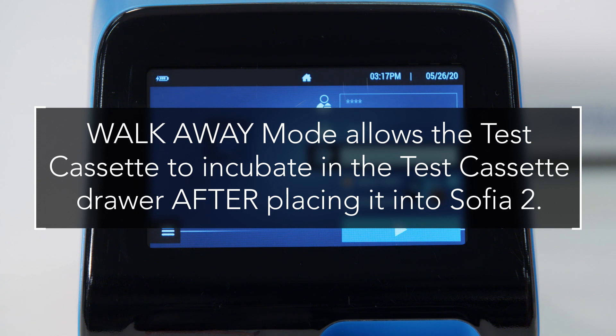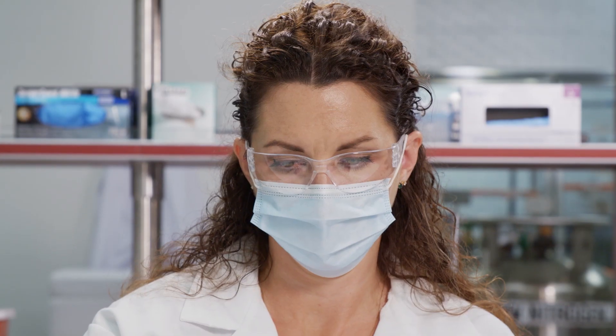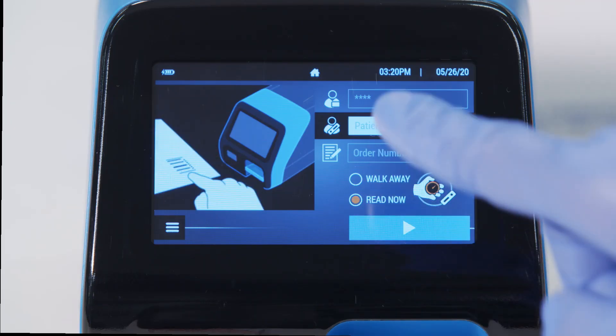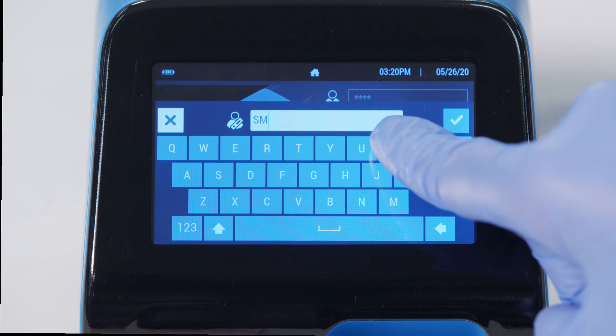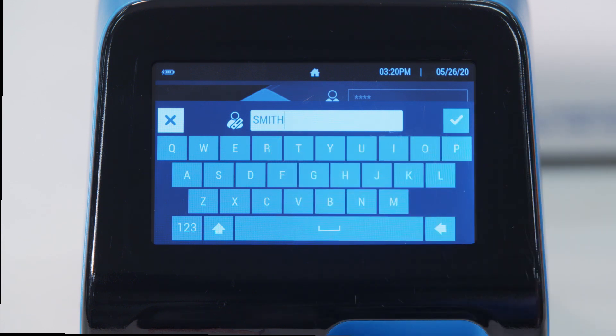SOFIA2 SARS Antigen FIA can produce positive, objective results in 15 minutes. To begin testing, after emptying the contents of the patient sample into the cassette, ensure SOFIA2 has been powered on and the run test screen appears. Enter the user ID and patient ID by using the touchscreen or integrated barcode scanner. If the user has manually entered the user ID or patient ID, press the check button.